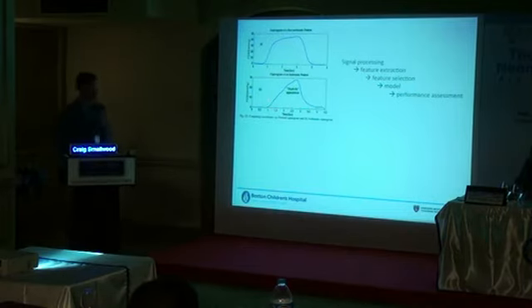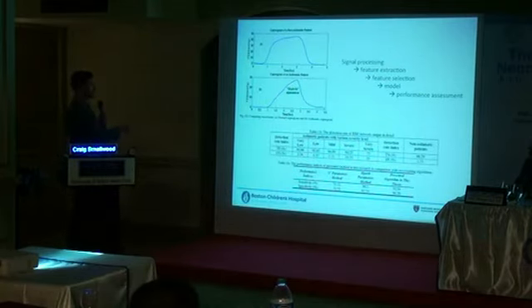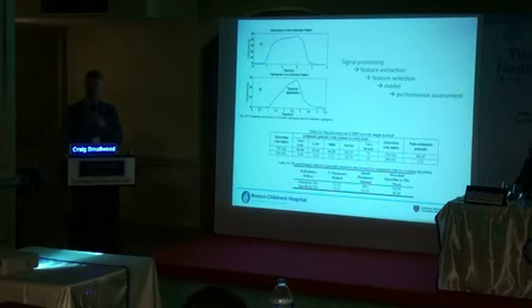But the process that they use is here. It's really kind of like a machine learning and data mining process. What they wanted to do is come up with an algorithm that can automatically detect this shape or the deviation from this as a function of severity of asthma. And then you don't need to subjectively interpret this with your own eyes, but the machine could perhaps alert you that you need to come look at your patient because the obstruction is worse, or maybe it's getting better, in either case.